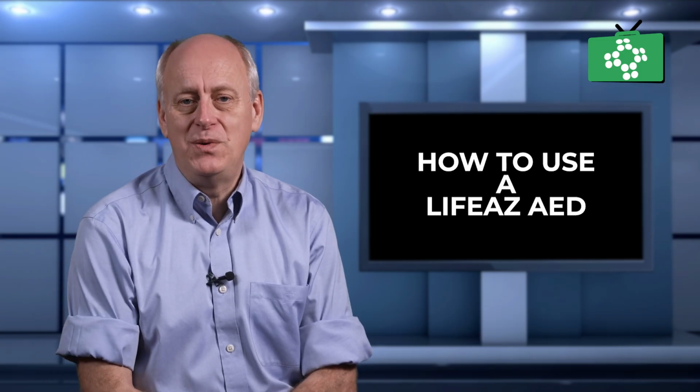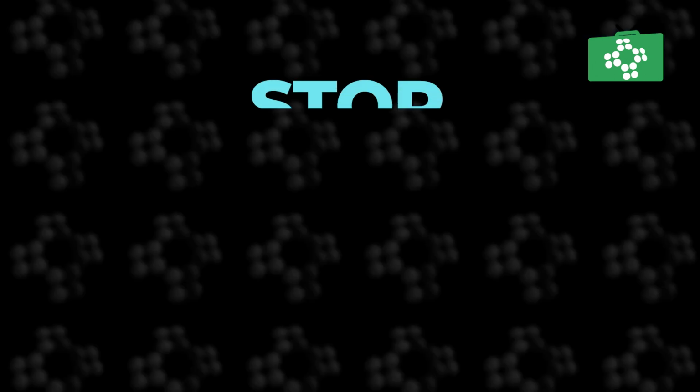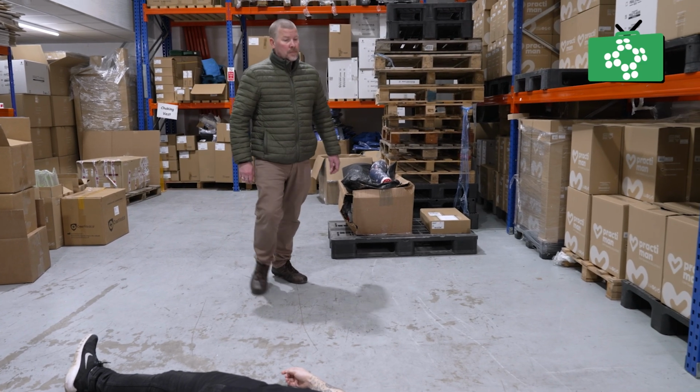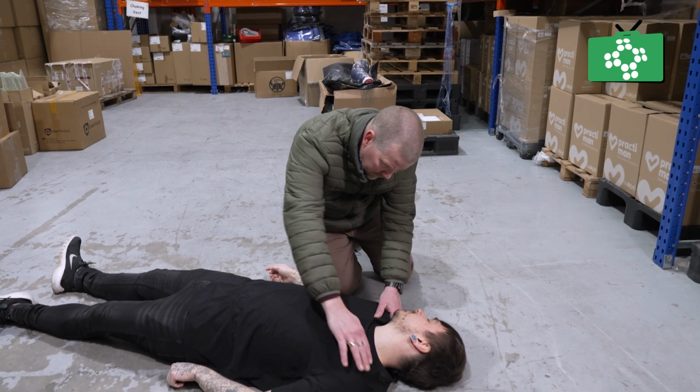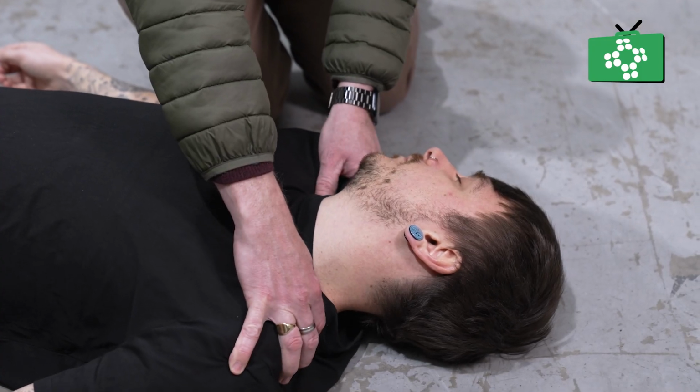Firstly, we need to approach and check the scene for anything that could harm us. Stop, think and act. If available, put your gloves on. But as there's not a high risk of infection and time is critical, we don't waste time looking for them. Once you're sure it's safe, the next stage is to assess the patient as you learned in CPR training.